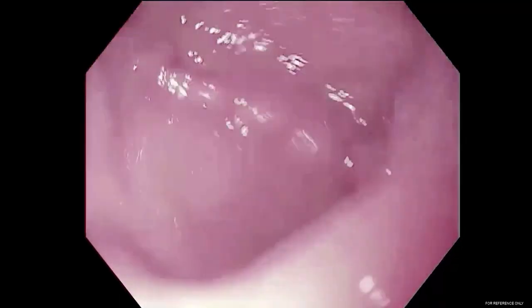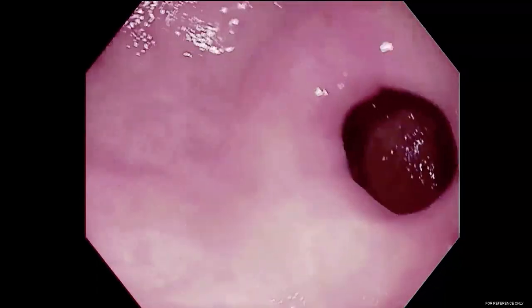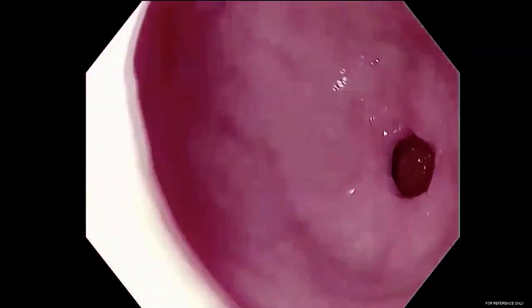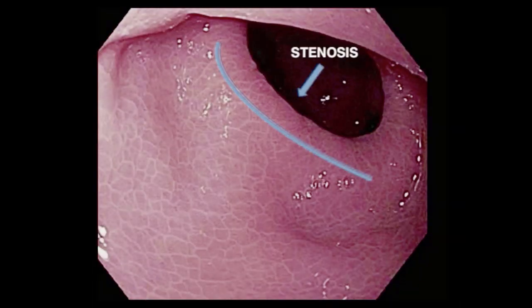Now we show the video of our patient. The first step is to identify the stenosis. During the EGD, we can see the gastric sleeve and quickly diagnose a stricture at the level of the incisura angularis. In this picture, you can see the stricture clearly.